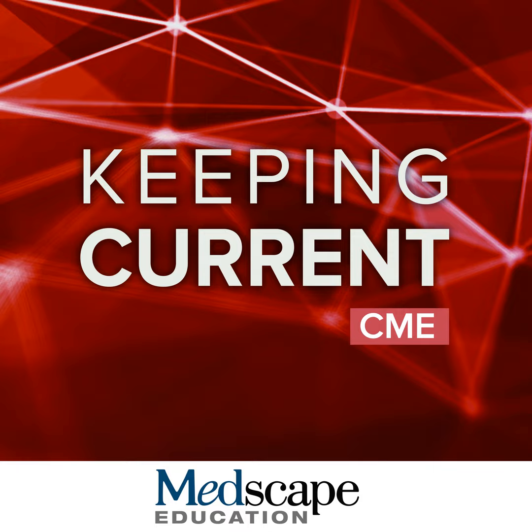There's also a little bit of improved specificity for HCC. You can see these two patients, very similar appearance of these small lesions with arterial phase hyperenhancement. The lesion on top has associated hepatobiliary phase hypointensity, and the lesion on the bottom is completely isointense. The lesion on top is LR4, confirmed to be HCC on explant, and the lesion on the bottom is LR2, probable vascular shunt, and we've been following it stable for 3 years, causing no issues.